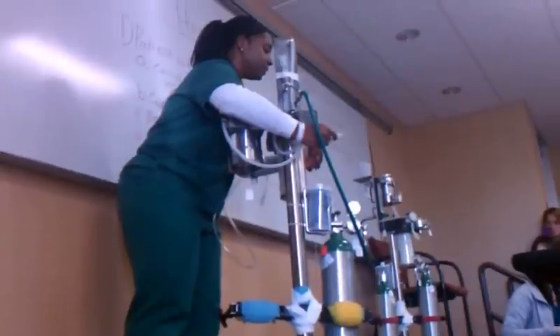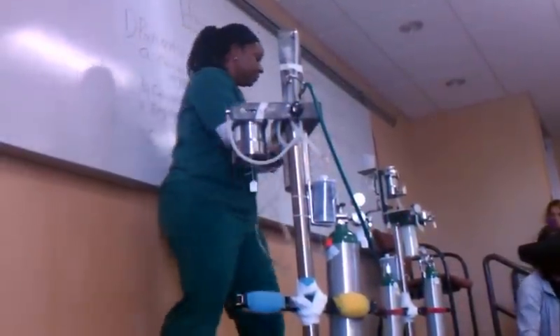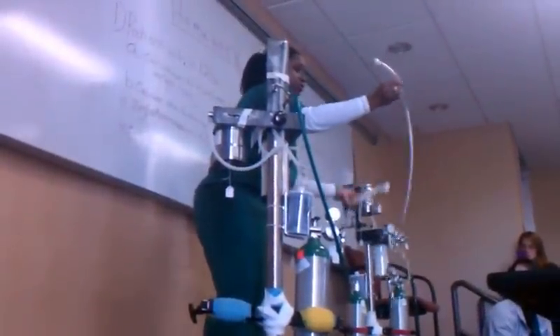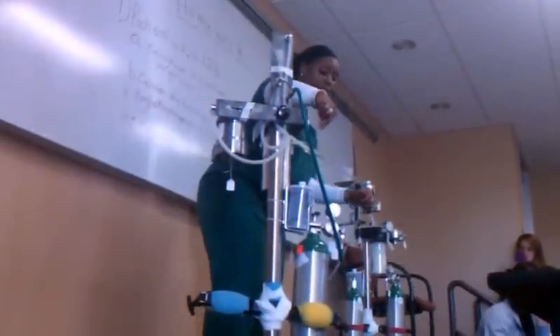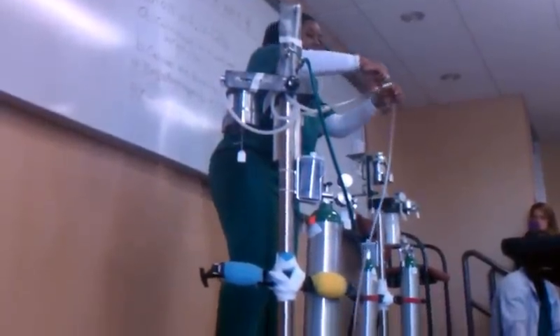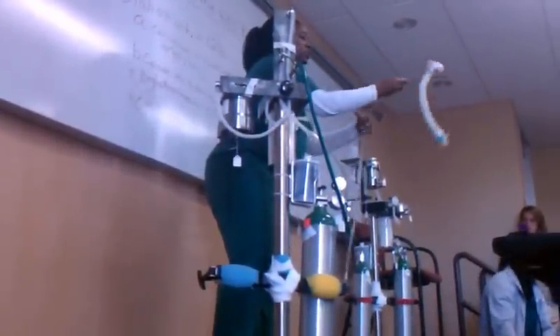We just unscrew it. Where it says fresh gas outlet, that's where we hook up the end of this long clear tube. Hook up the end of the long clear tube to the fresh gas outlet. Now any isoflurane and oxygen is coming from the machine through the clear tube to the patient.